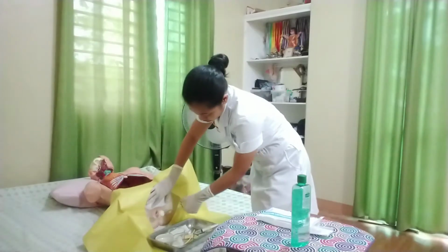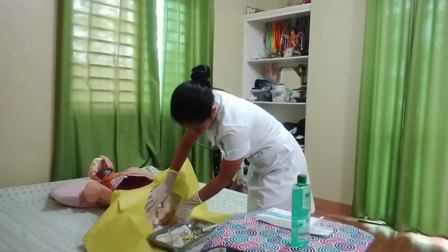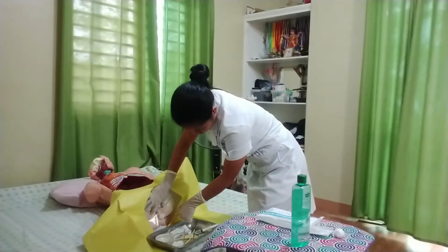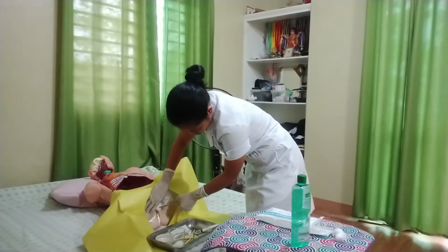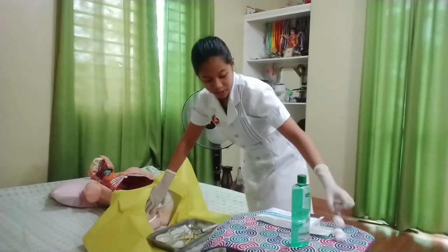So first, we will start on the farthest area. So 1, and then we will discard. And then 2, we will then discard. And then 3, down to the meatus, down to the rectum, and then discard.